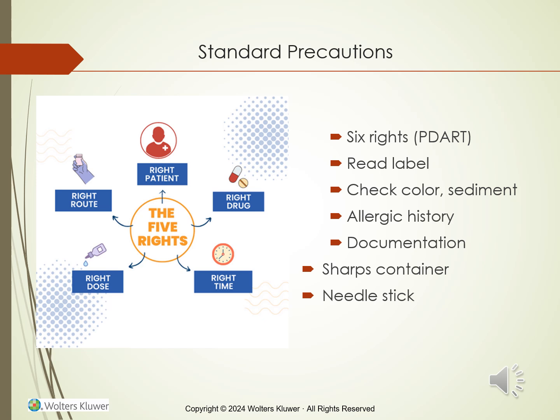You want to check and inspect the vial to make sure that it's not been tampered with. Make sure the color of the contrast or drug is appropriate and there is no sediment. Does the patient have any allergies and potential for reactions? Anything should be documented. A needle that has to be injected into a person should never be recapped.